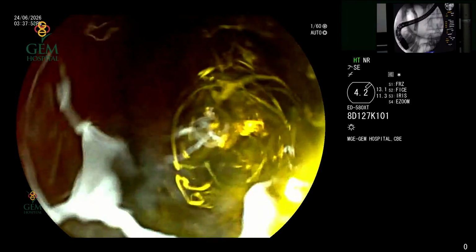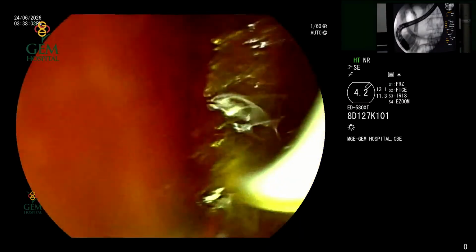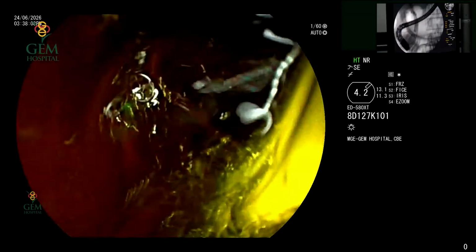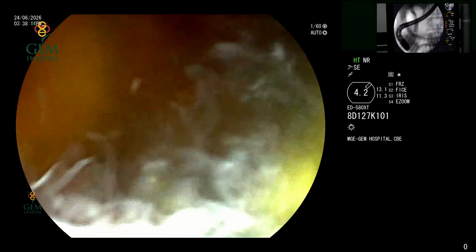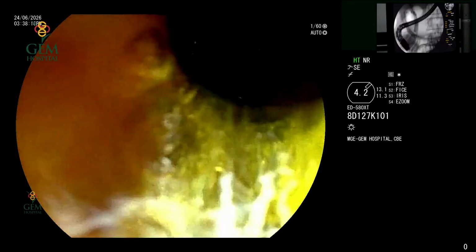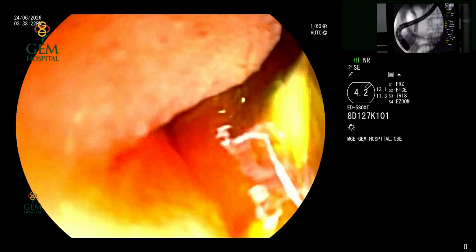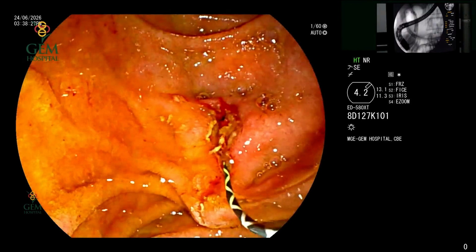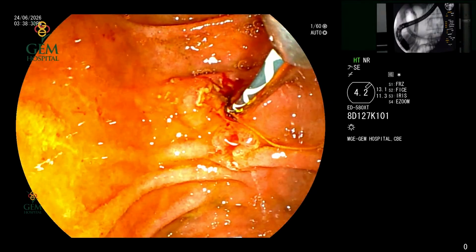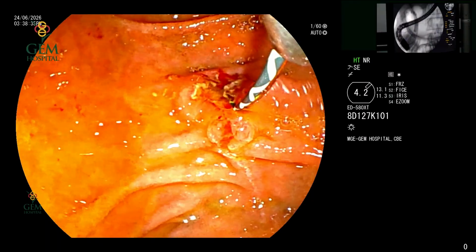If you see in the cholangiogram, we can see a small, tiny circular structure, which is a filling defect we call it, but it can be an air bubble, which is an artifact. Basically, how do you differentiate a stone from an artifact? A stone remains stable, it does not change its position, whereas an air bubble tends to float, it changes position, it passes away, and with more trawling or inflation, it basically comes out. When we continuously look at another screen of the cholangiogram, we can see that the bubble is no more there. So mostly what we saw was an artifact or an air bubble.